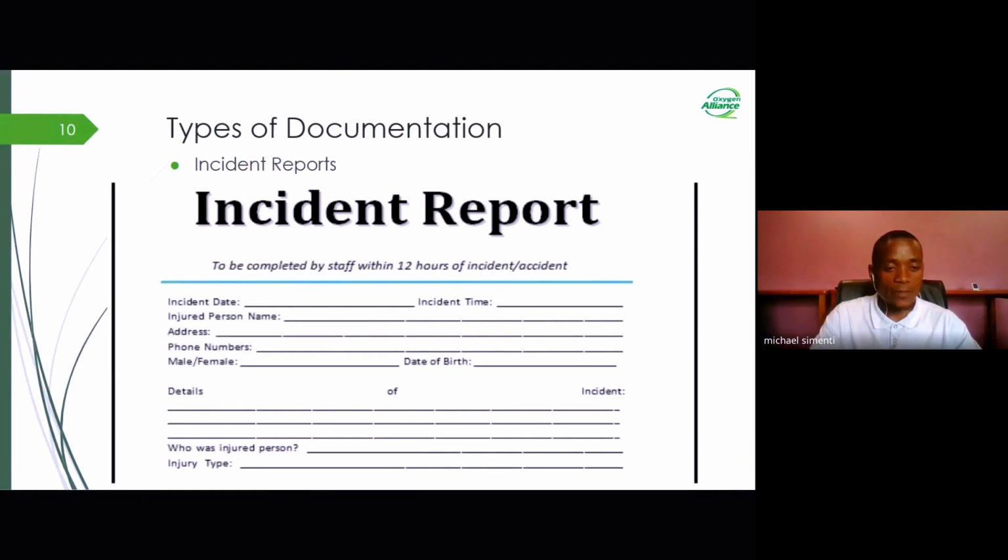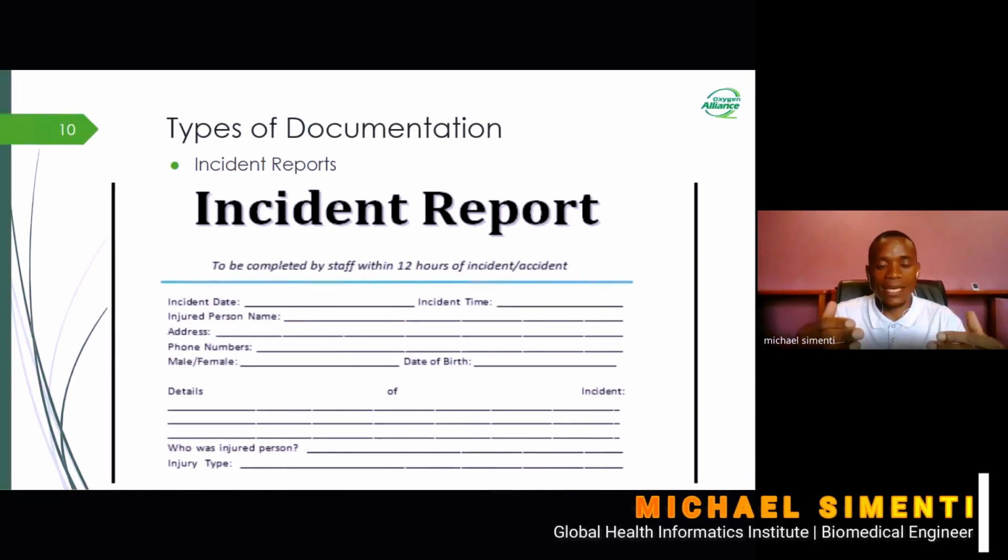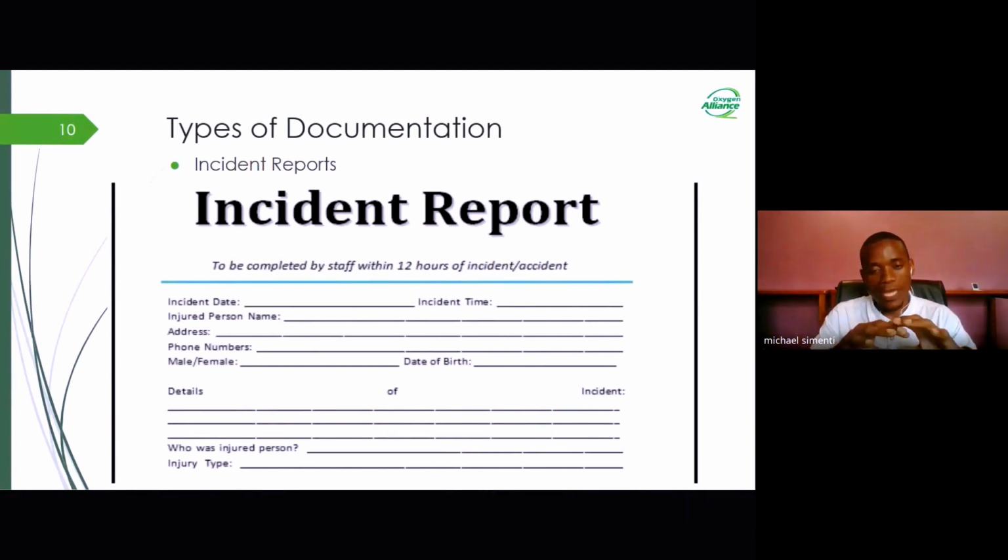The information you expect to have is, for example, when it happened, so you put the date, and the location where it happened, whether it was at base, in the workshop, in any department, or any other place. Who was involved? What injury has been sustained? Any immediate action which was taken? What was the root cause? All that has to be documented. And if you put that information in the report like this one, it's very easy for somebody to follow up, right?